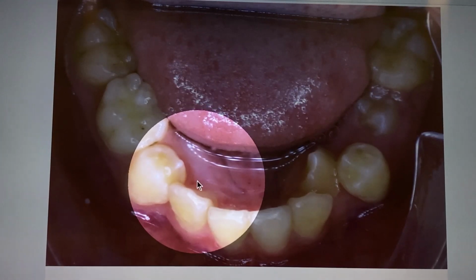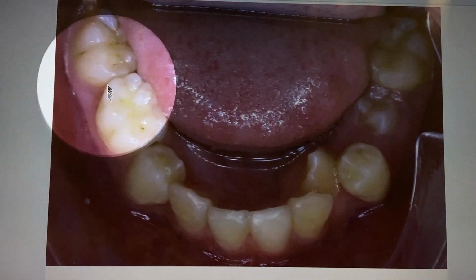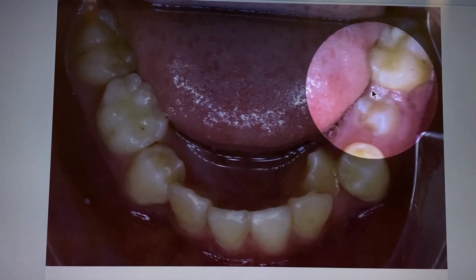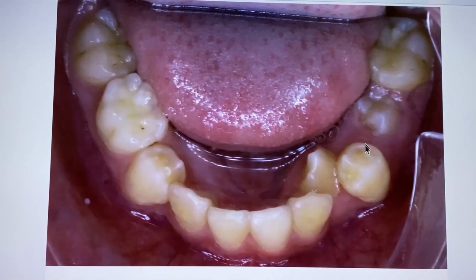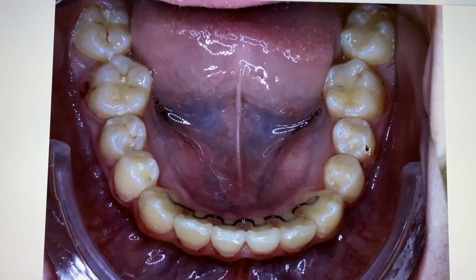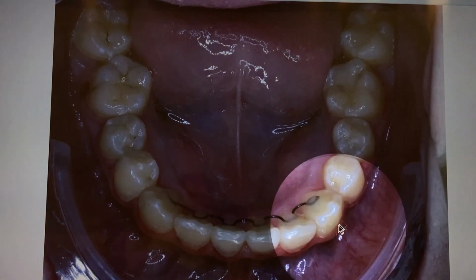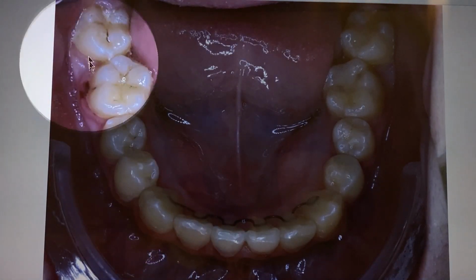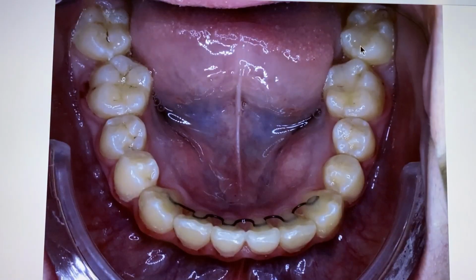But what's going to help us is that he still had this big baby molar left. As you can see on the other side, when you lose the baby molar, you actually pick up a little bit of space because the adult tooth that replaces the baby molar is a bit smaller in the bottom arch. And after we expand and create space for him, we allow the canines to come in at both sides. And on top of that, we get enough room to fit all 14 of the lower teeth here, without any removal of healthy adult teeth.